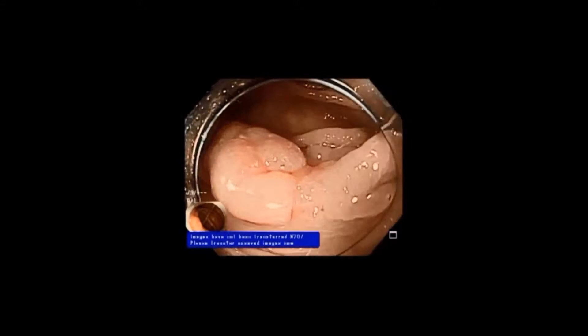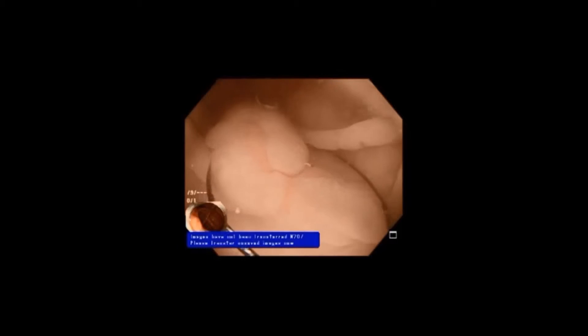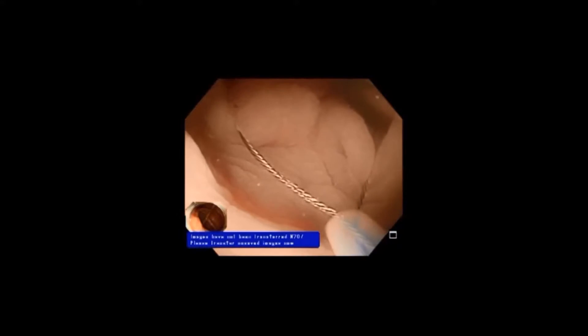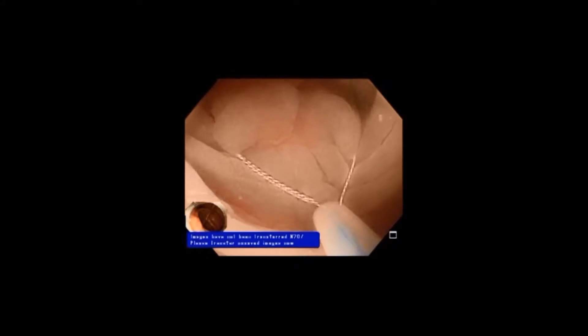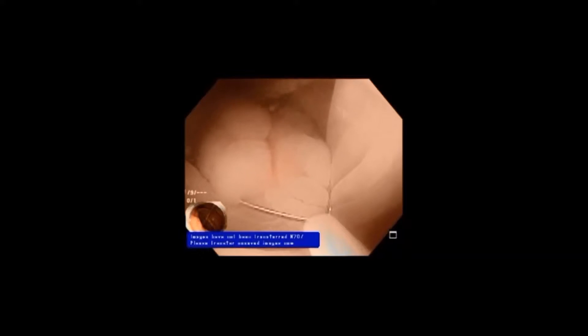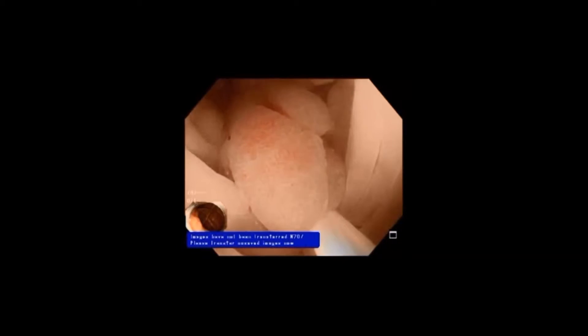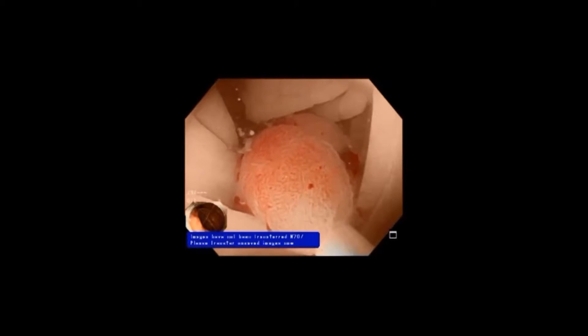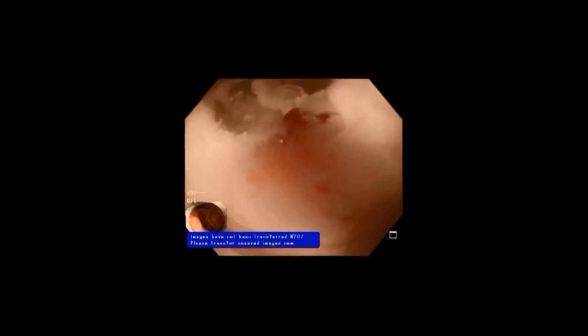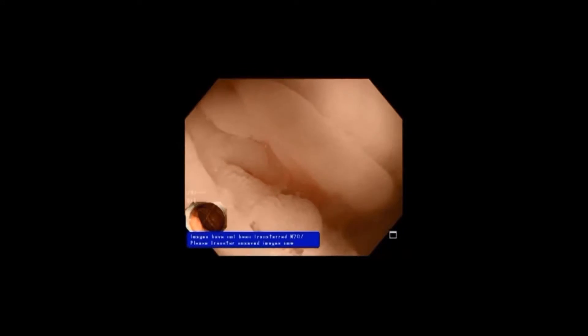Some of these underwater resections I'm going to show you are from my initial experience, which I think is useful because we're all sort of beginners at the present time with this, except perhaps Ken Benmohler. This is the kind of lesion I found it to be often helpful in — one that is scarred down. About half the lesions referred to me have some degree of scarring from a previous attempt at EMR. This one has some scarring along the right-hand edge, and the snare seems to dig in along that scarred area a bit better underwater than in gas-insufflated EMR, perhaps because that tissue tends to float a little bit. But I didn't get it all — you can see there's some red tissue on the edge closest to us, and a little bit of residual polyp.